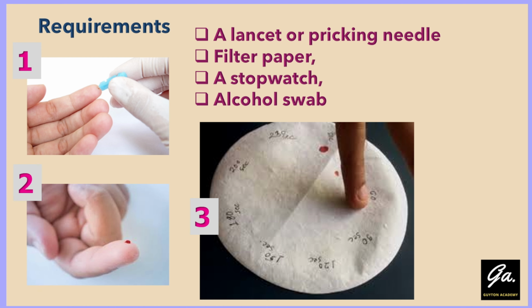Don't be confused between bleeding time and clotting time. In the clotting time, we use a capillary tube to see whether the fibrin clot is formed or not. In the bleeding time, in this practical, we use filter paper to see when the bleeding stops.